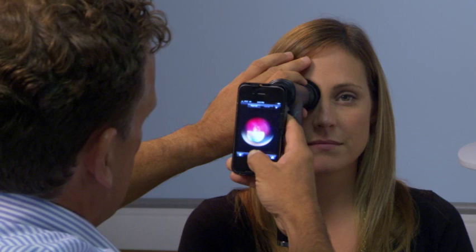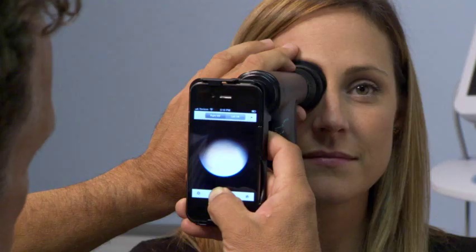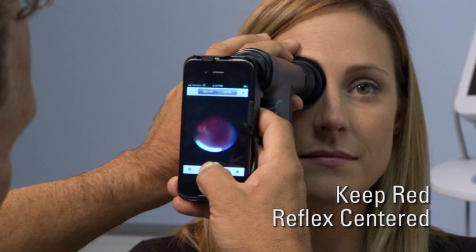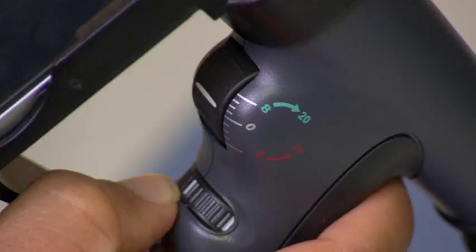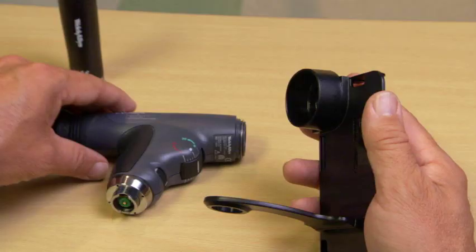The iPhone camera should do all the focusing for you, but if your image is not in focus, try the following. Check to see that the focus wheel is set at zero. Make sure you are keeping the red reflex centered on the screen, otherwise it may be focusing on a different part of the eye. If the image is still blurry, adjust the focus wheel to compensate for refractive error. If the view seems too small or narrow, make sure you have the large aperture selected.